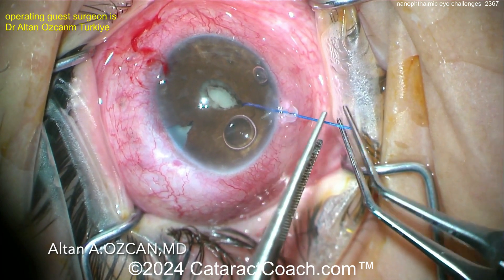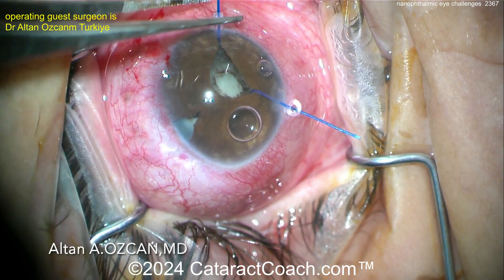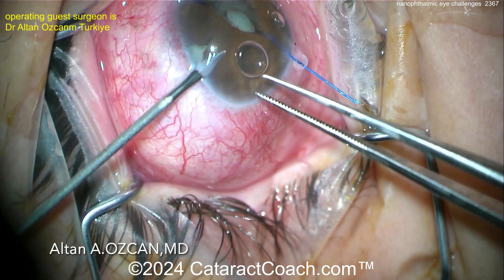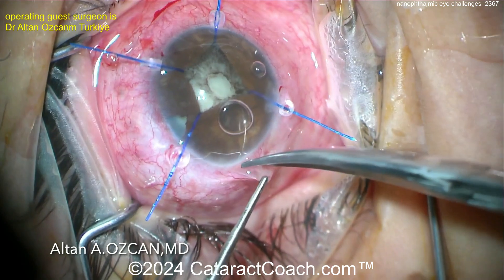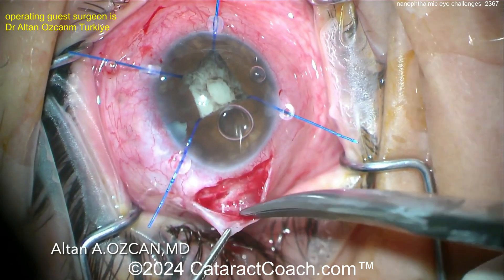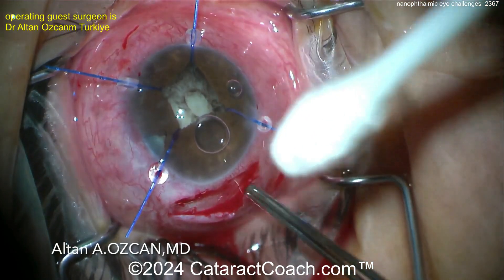Place the hooks a little bit and then don't fully tighten them up — just go round and round. Put in all the hooks, do a little bit of tightening, then come back and retighten all of them to get a little bit more stretch. This is a very challenging, very tiny eye. There are high risks here. The surgeon will do a little bit of a peritomy and a tiny bit of pars plana anterior vitrectomy.